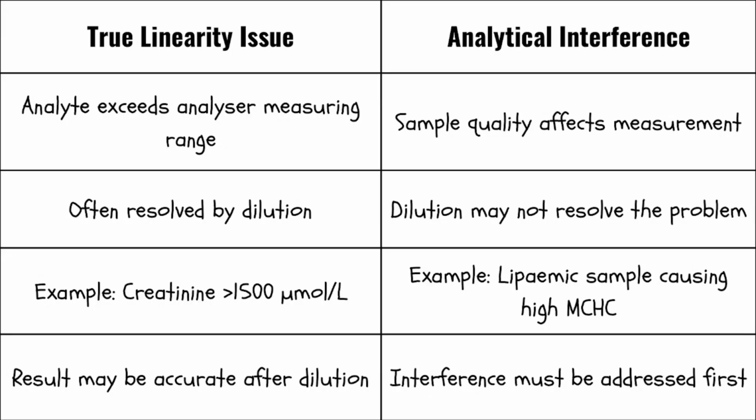However, I want you to see the other way around. Let's say in full blood count especially, when the plasma is highly lipemic, okay? It can also happen in coagulation, even in biochemistry. But I'm using this because that will make more sense. So in full blood count, a lipemic sample can make the MCHC high. It does not mean that the MCHC is truly high. The same way, if a sample is hemolyzed, let me also give you another example.